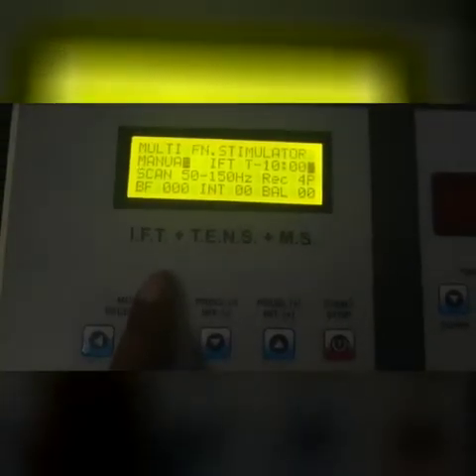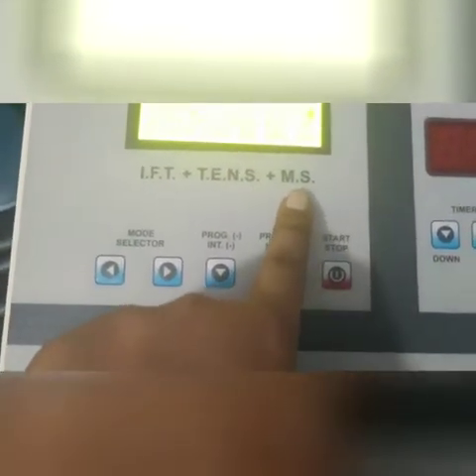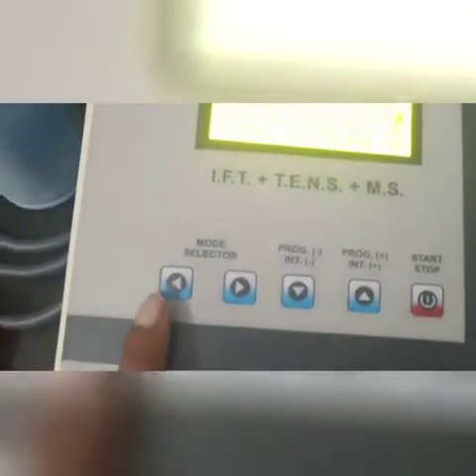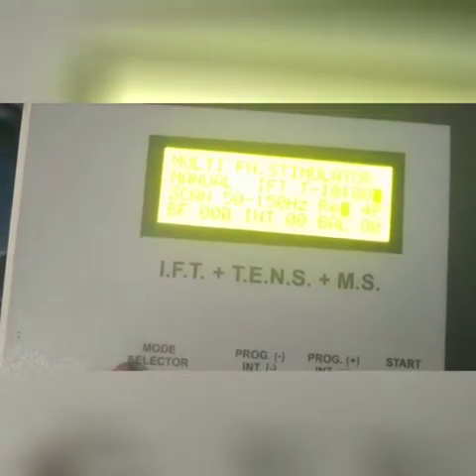Programs 1 to 70 are for IFT, 80 to 100 are for TENS, and 100 to 125 are for MS. I can select the mode from here and increase or decrease the program from here.